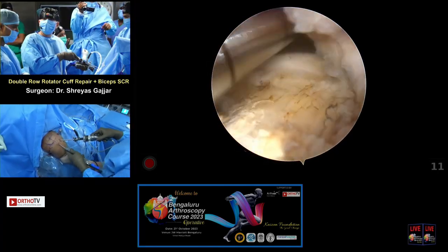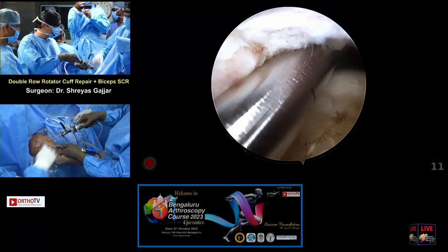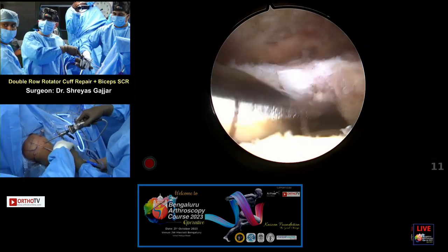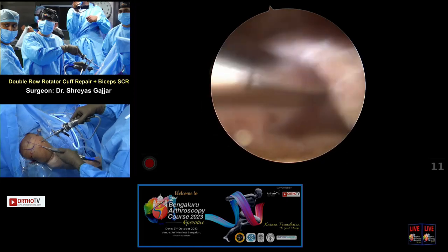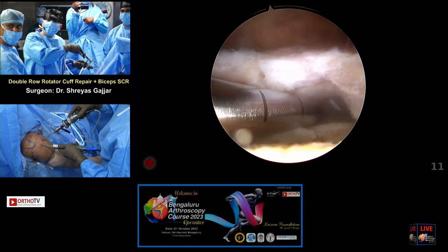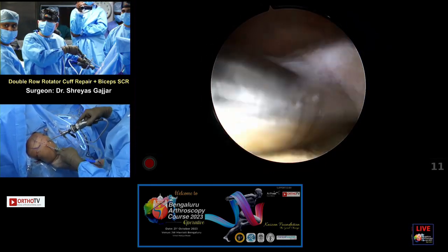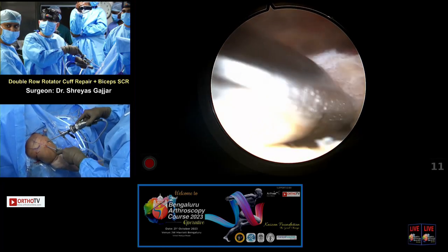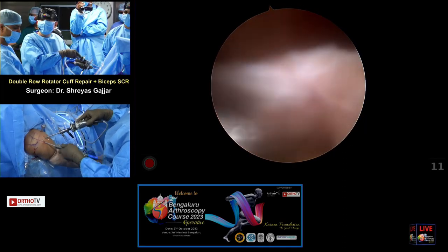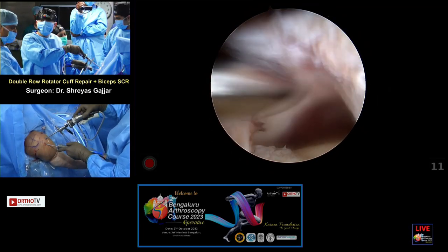So the delamination part, I'll just answer that. Can you hold the shaver, please, Akshay? What we are going to check is, it's important to just clear the irregular edges of the cuff to ensure a smooth area of contact on the cuff footprint, as you see here. I don't see a delamination here. It is just that this is the medial part, this is the lateral part. There's no delamination. Does that answer your question? Yes, sir. Okay.